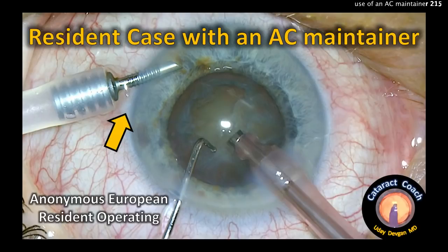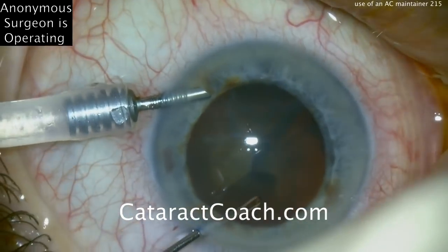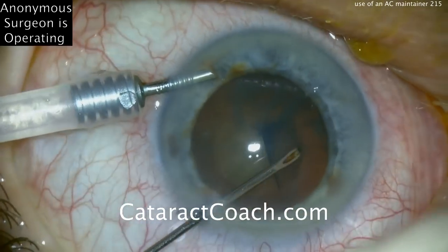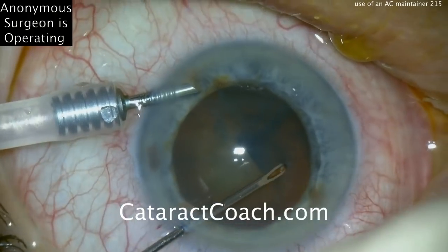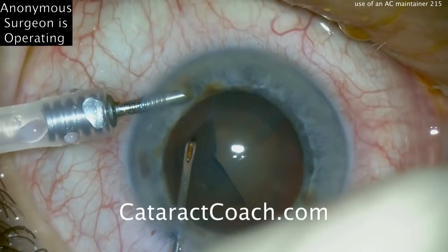CataractCoach.com. That's an anterior chamber maintainer. This is an anonymous resident from Europe who's doing the cataract surgery. Of course the video is sped up, so we don't have to spend too much time on the easy steps.